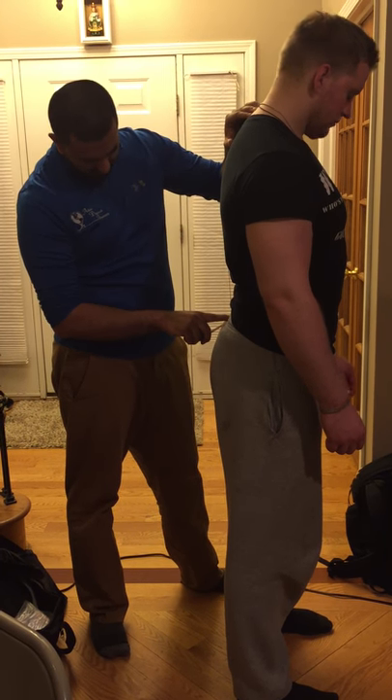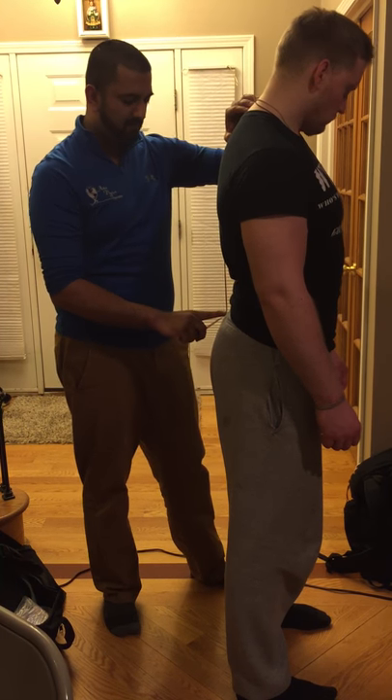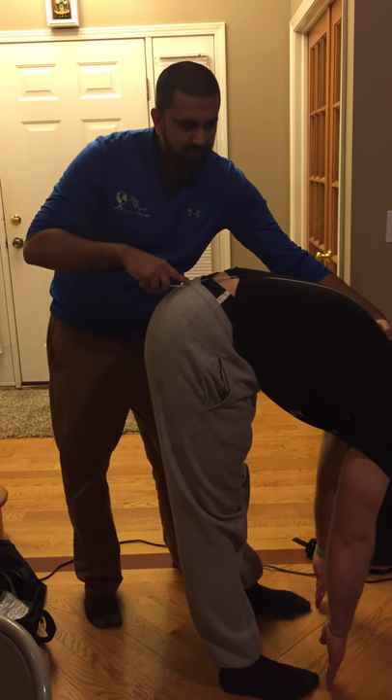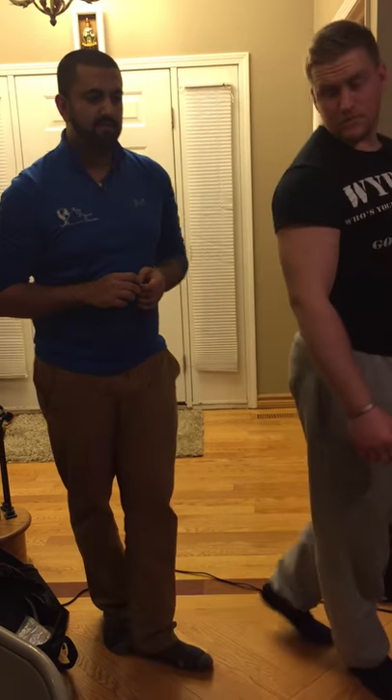He measures about 53 centimeters. I'm going to tell him to bend forward and try to touch his toes. I then measure to about 68 centimeters, so he has about 15 centimeters of flexion.